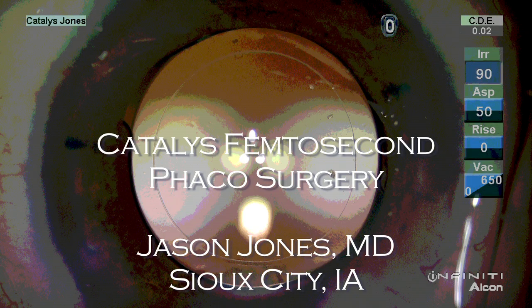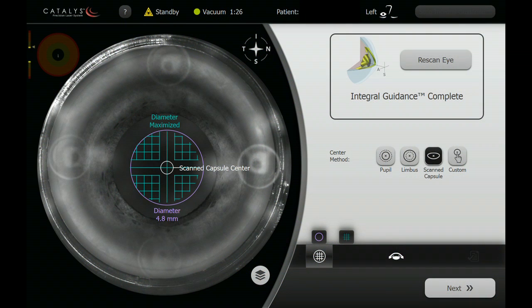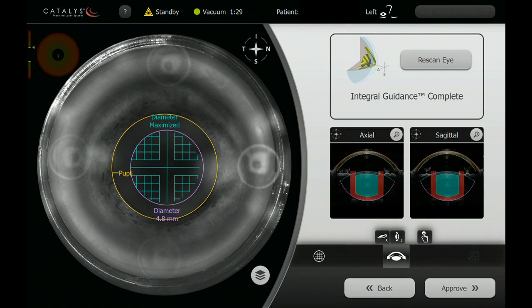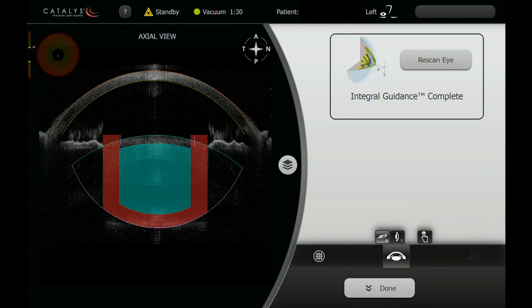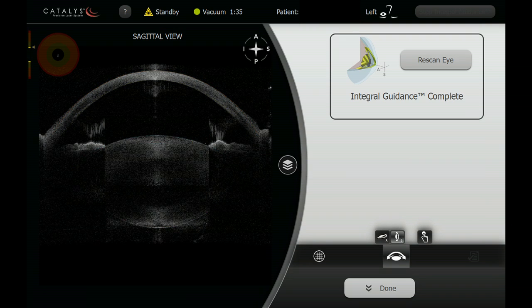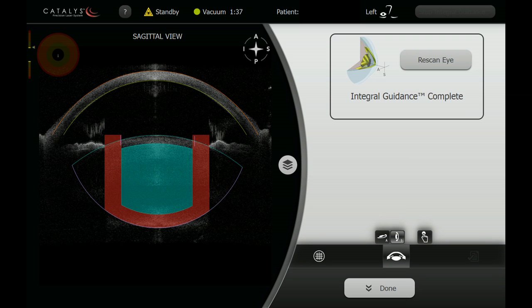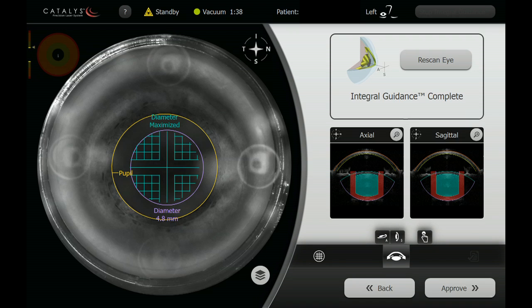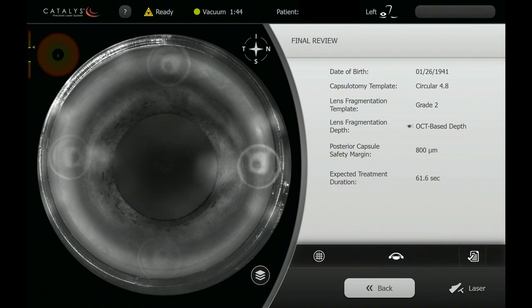Hello, my name is Jason Jones. I'd like to share with you a fairly typical femtosecond-assisted cataract surgery. This patient has had the mapping and analysis of his anterior segment structures, and we're confirming surface fits to the cornea and lens, both axial and sagittal.